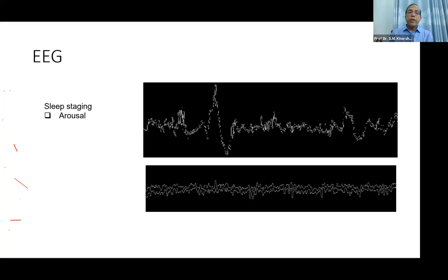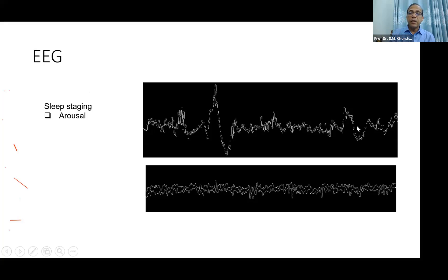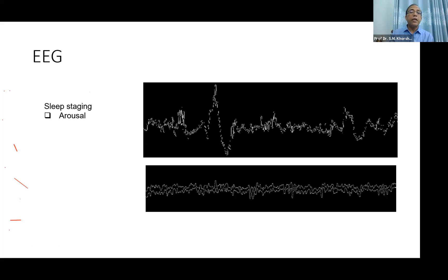In EEG, this is the arousal curve. When someone is passing through EEG recording, we can see how many times arousal occurs. All these events are not sensed by the patient.